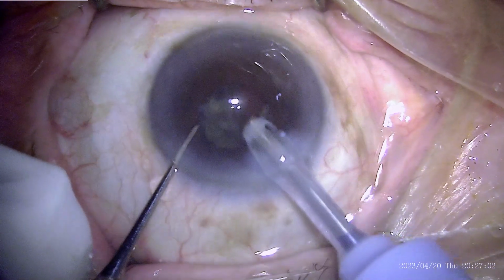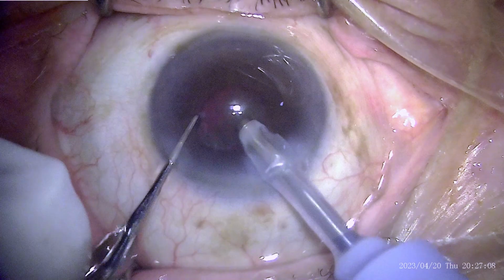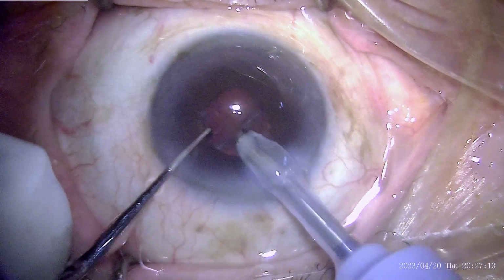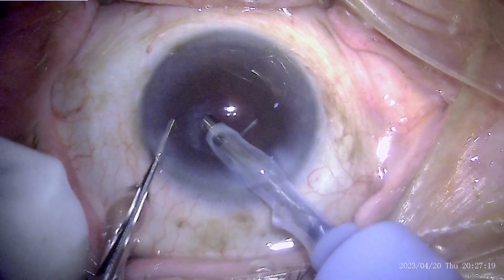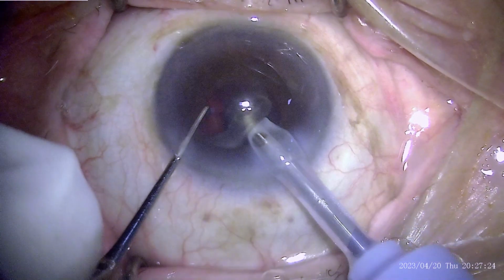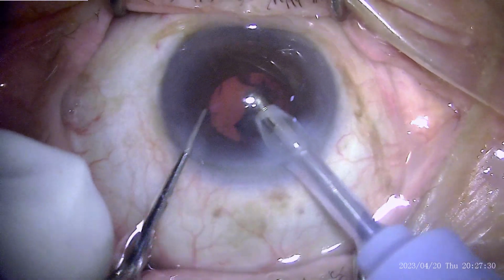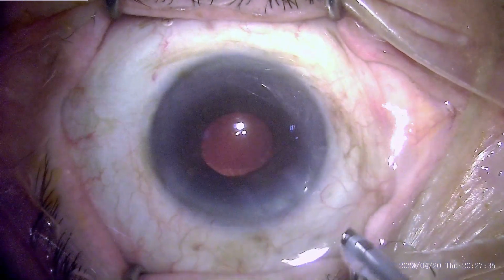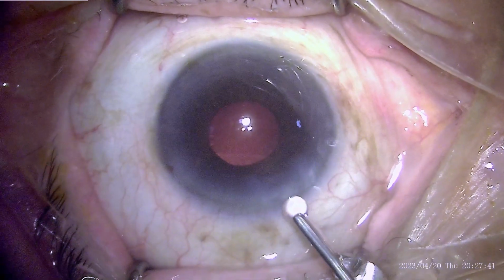We can see half of the nucleus and more has been removed, and one can see now the nucleus is completely gone. One has to make sure that every possible bit of nucleus is removed, and here we can see the epinucleus is engaged, lifted up, deformed, and then consumed in the center. One has to be very sure that none of the iris tissue is aspirated in this process. Now what we are left with is just peripheral cortex, which will be removed using an irrigation aspiration cannula.